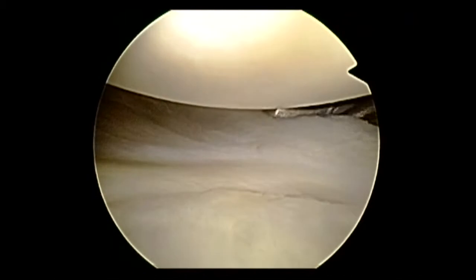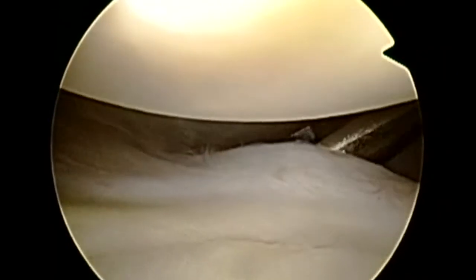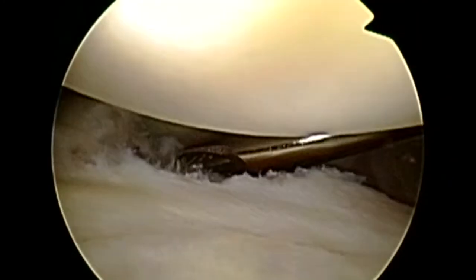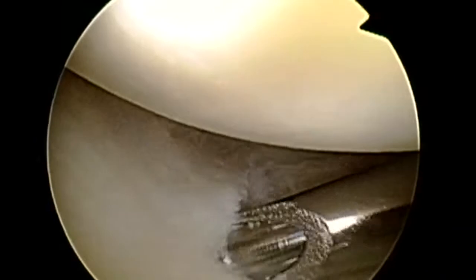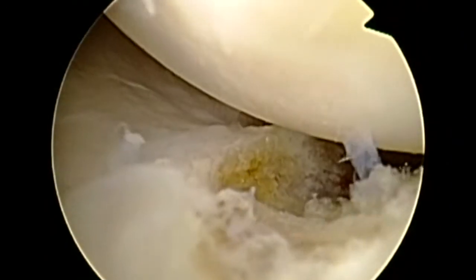She had decreased external rotation both at her side as well as in abduction, and so we're going to perform an anterior and an anterior inferior capsular release. We use a combination of arthroscopic either biters or something sharper like a capsular punch, and then once we've released the capsular tissue, we also perform a capsulectomy.